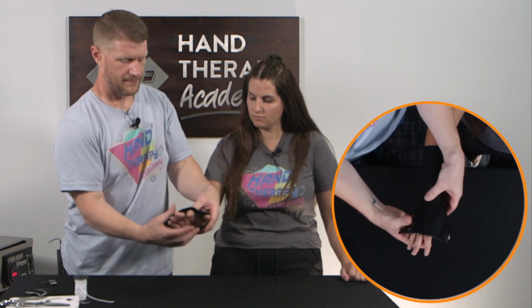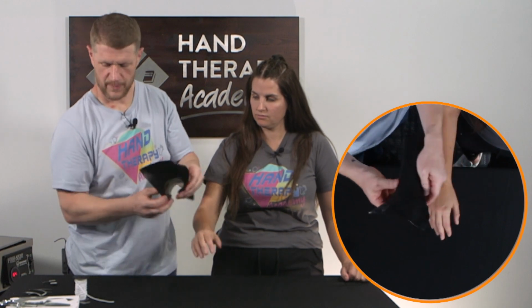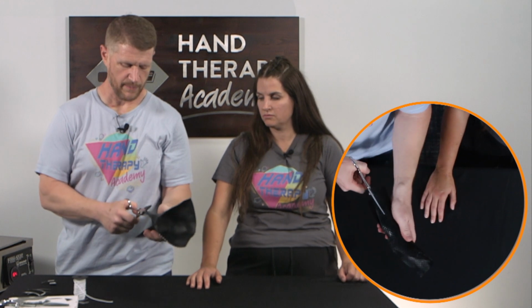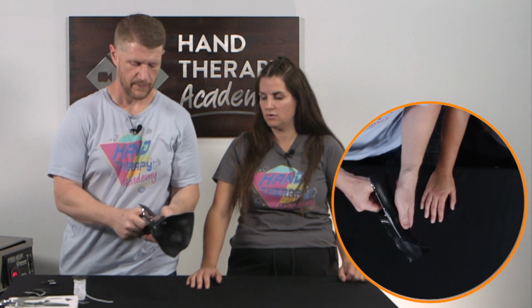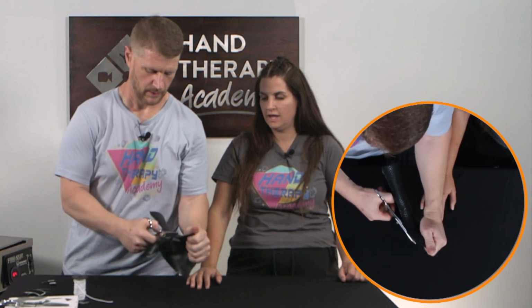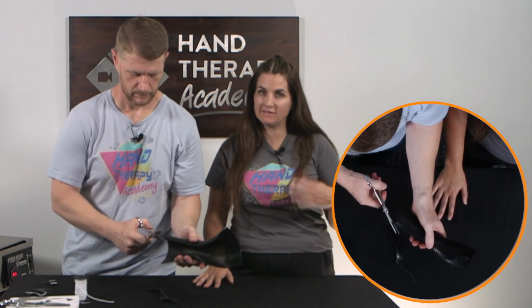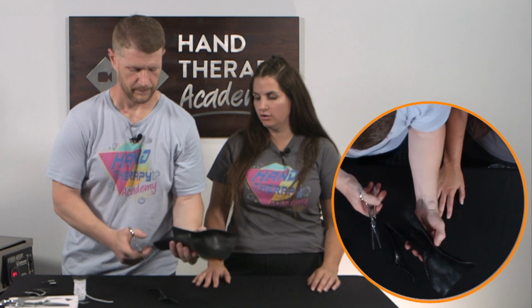Fingers are starting to get set, so we'll untag that and we'll trim that down. And I'm just going to go on that halfway mark of where the wrist and forearm is. And if you struggle with where that is, you can always mark it with the pen or your nail.